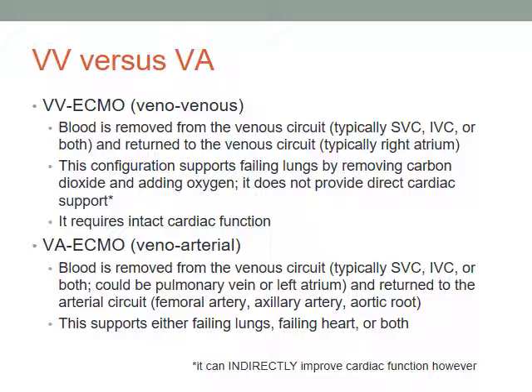But that's VA. So VV, suck out of the vein, return to the vein. VA, suck out of a vein, return to an artery. Important distinctions, and they're completely different in how they function and support the patient and the things that we use them for.